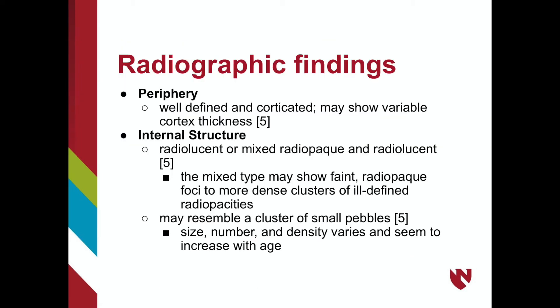On a radiograph, an AOT lesion usually displays a well-defined and corticated peripheral border of variable thickness. In two-thirds of cases, the internal appearance of AOT lesions is either largely radiolucent or mixed radiopacity. The appearance of the mixed radiopacity may vary from a faint, delicate, radiopaque foci to one with more dense clusters with ill-defined calcifications present.